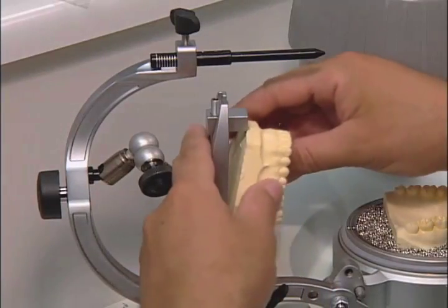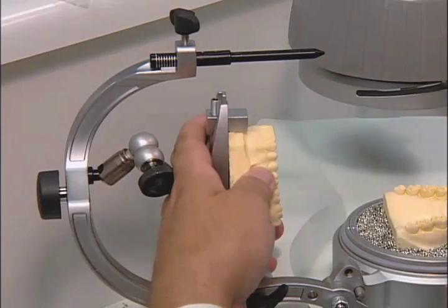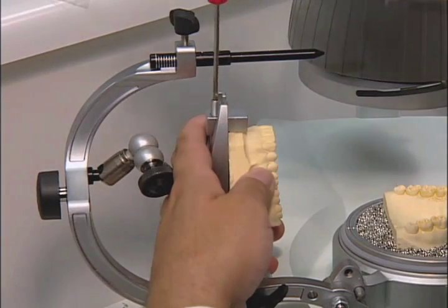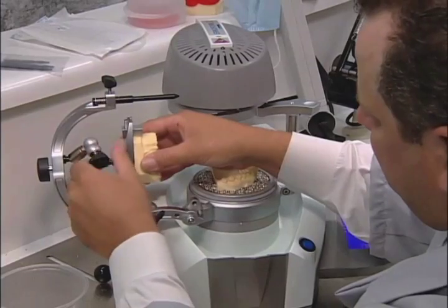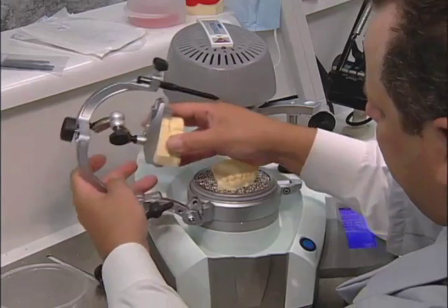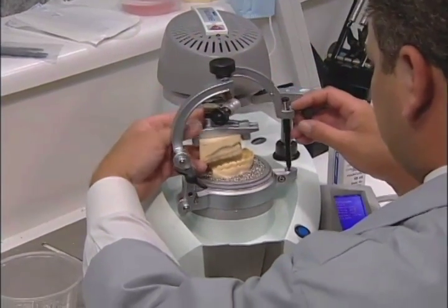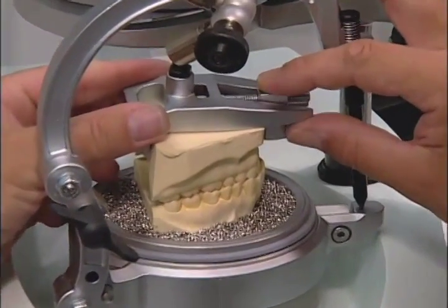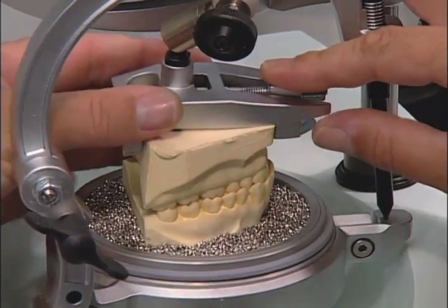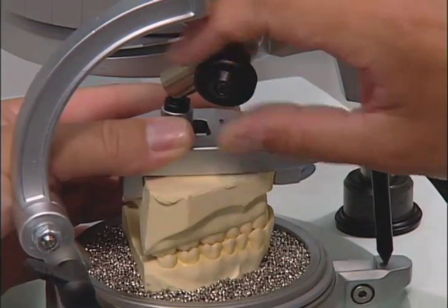Place the opposing model in the holding plate and tighten. Then loosen the upper holding plate screw and place in centric position. When in place, tighten the screw.